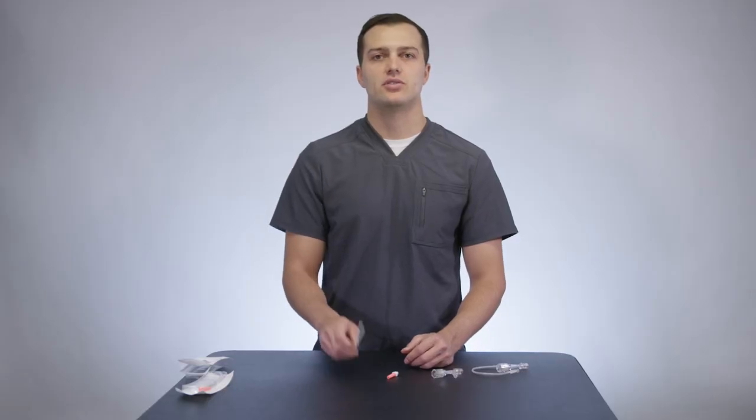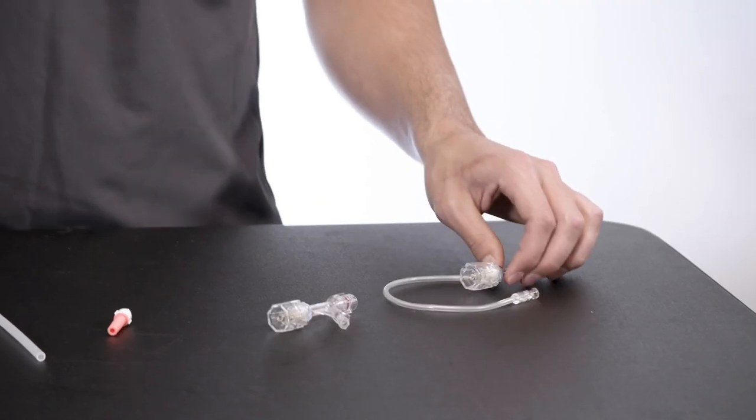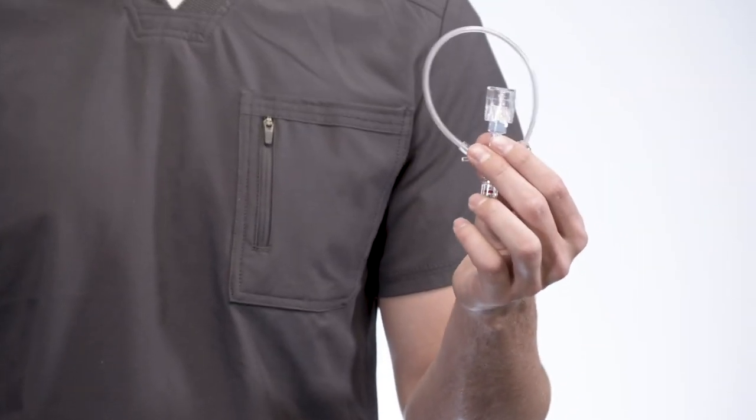In the packaging you'll find an insertion tool as well as a torque device for your convenience. We also have a configuration with a bonded 9-inch sidearm extension tube.